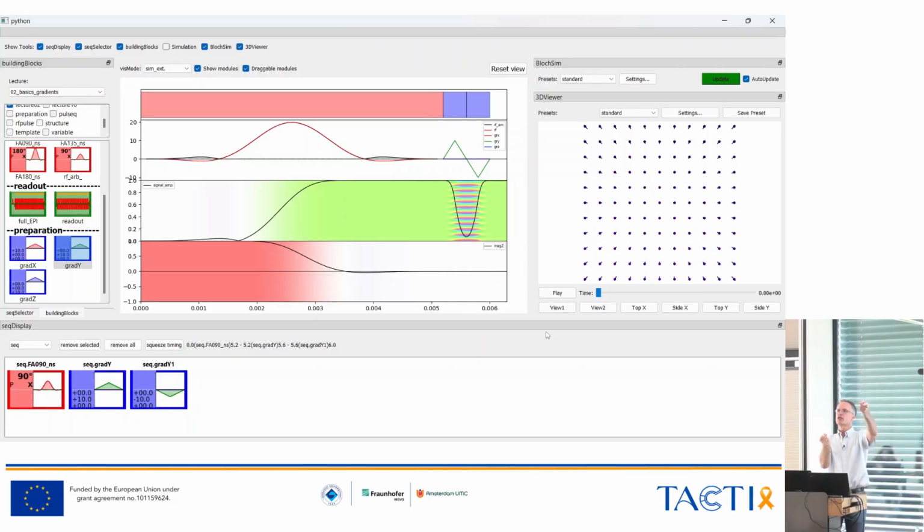And that will just, because now those which have been in the higher field regime will now experience lower field, and it's exactly balanced so that after playing this out, everything is aligned again and is showing in the same direction.